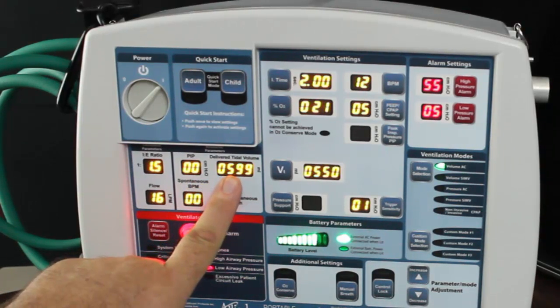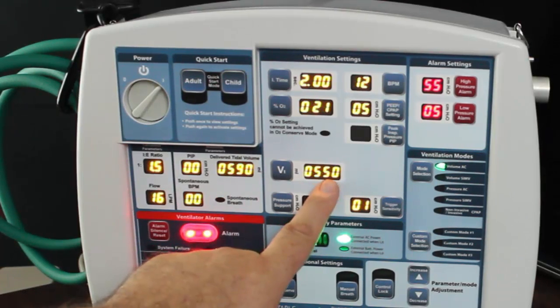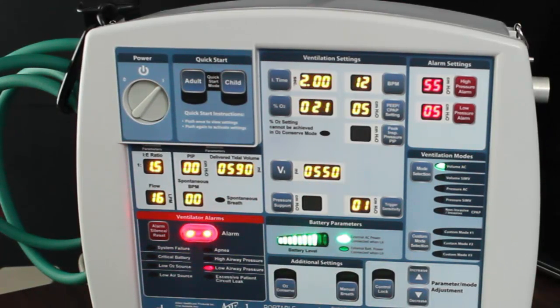Tidal volume shows 599. We have it programmed for 550, so it is giving more air than what you have programmed, because there is not a circuit hooked up.